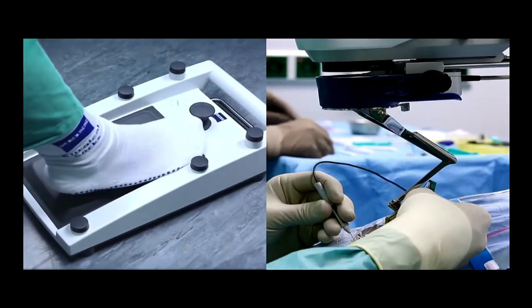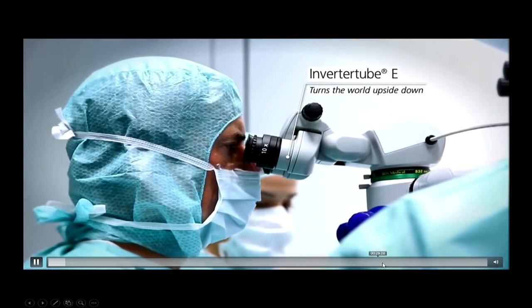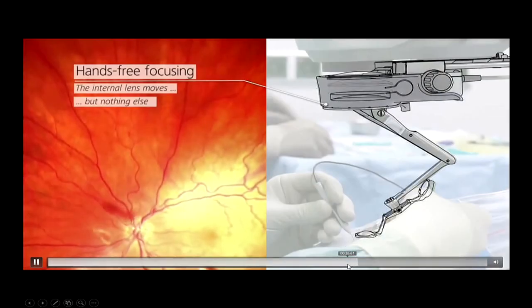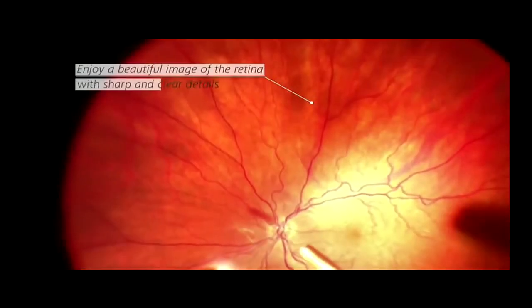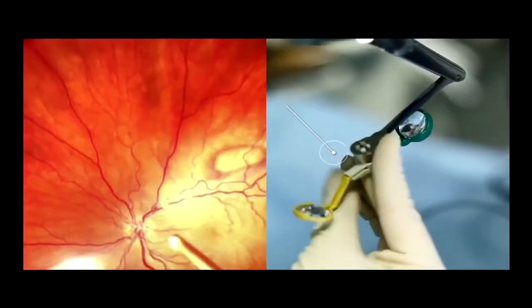And when you press the focus here in ReSight 700, the focusing happens here because the movement of the lenses happens here. That you have to do manually in ReSight 500. So that's the only difference.